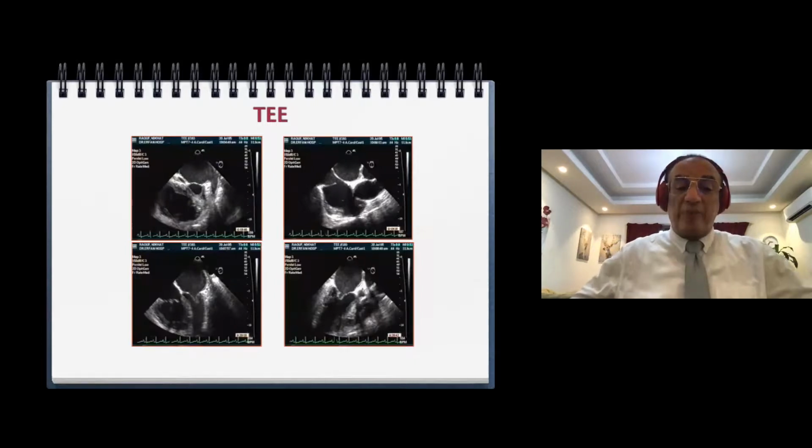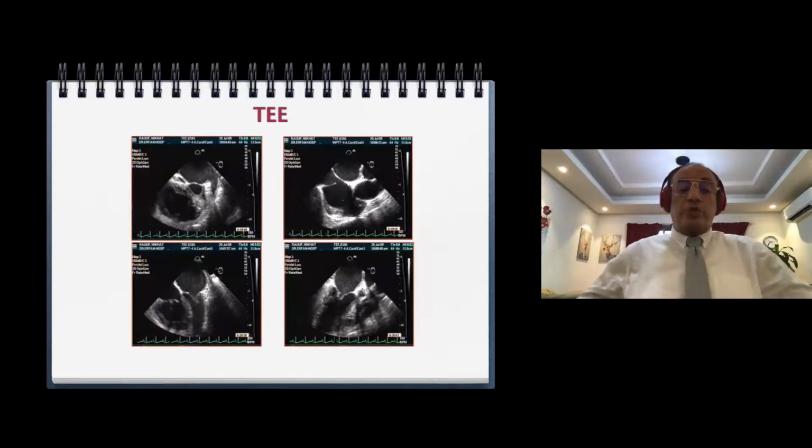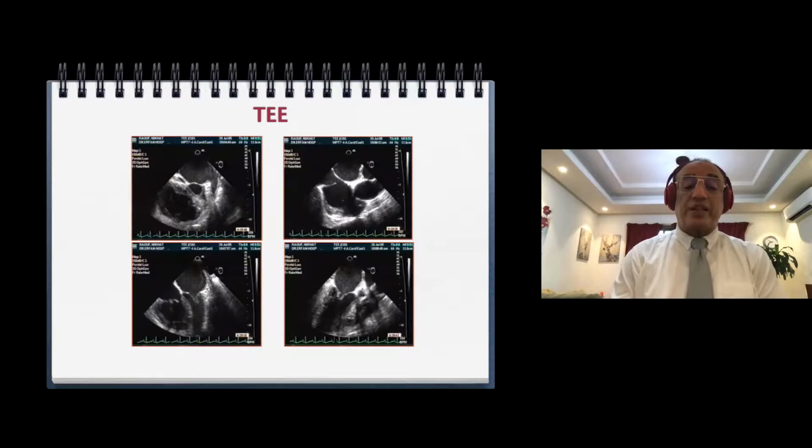This is transesophageal echocardiography, and it's mandatory to do transesophageal echocardiography to assess the thickness of the interatrial septum and to assess the left atrial appendage. It's clear here, no left atrial appendage thrombi, and there is no left atrial thrombi. The only finding here by transesophageal echo is heavy smoky shadow in the left atrium indicating stagnation of the flow, but there is no thrombi. And the morphology of the mitral valve here, we give a score less than 8. So this is favorable for balloon mitral valvuloplasty.